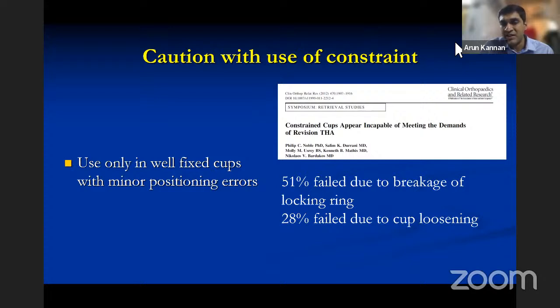Bipolar has a larger head than a dual mobility. But because the human acetabular cup is shallow and generally subtends an angle of only about 155 to 160 degrees, we get an additional component of stability from using a hemispherical acetabular socket. That's how dual mobilities have been shown to work in dislocating bipolars. Even though the head size goes down, the stability increases because we get a hemispherical shell.